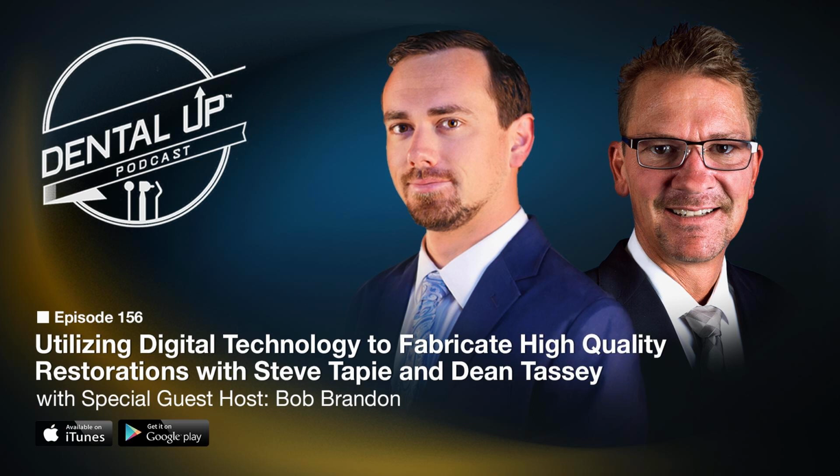So we can design those that we do like. If we want authentic parts, whether it be a Straumann or Nobel, we like using authentic scan bodies. We can go around that if you wanted to use a different type of abutment and an authentic scan body, but we have to print a model first so we can utilize our desktop scanner here in the lab to do that. But yeah, it's seamless.